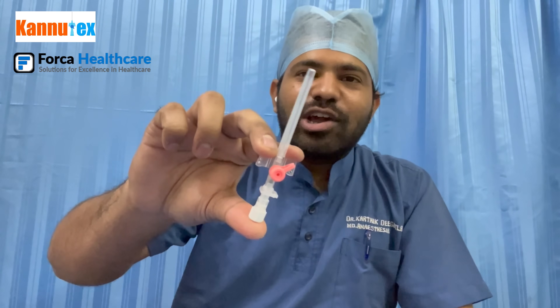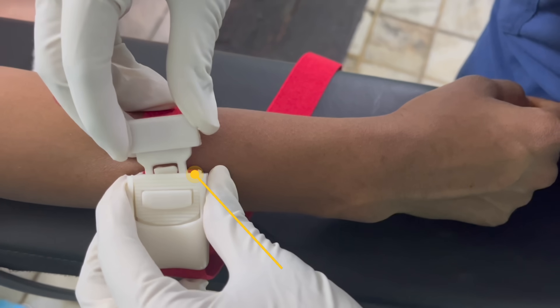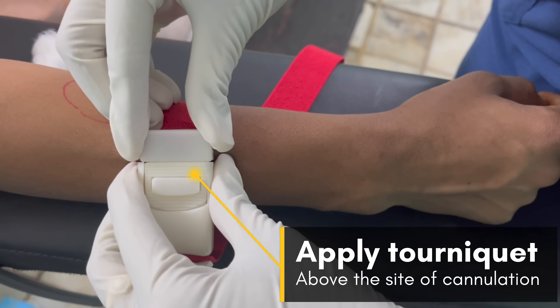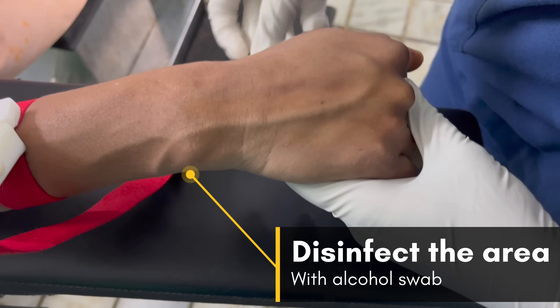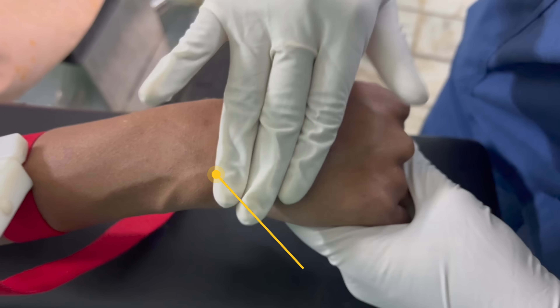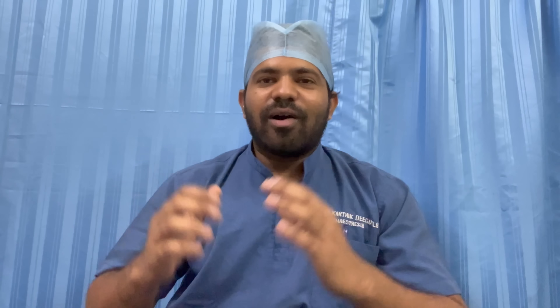Here we are using a 20 gauge X cannula by Forka Healthcare. Step one is to identify a good vein. Apply the tourniquet above the site of cannulation. Disinfect the area with an alcohol swab. Identify a good vein, dilate it by gently tapping over the vein, and let the site dry.